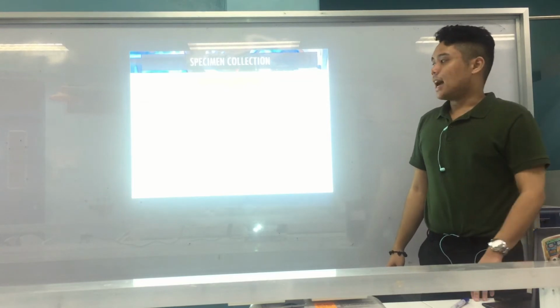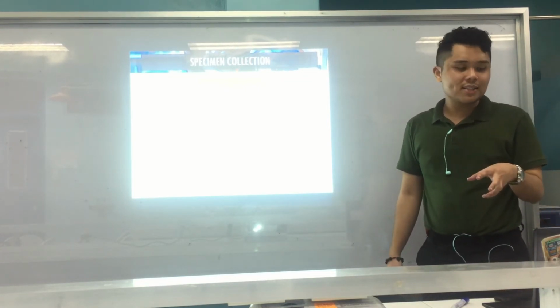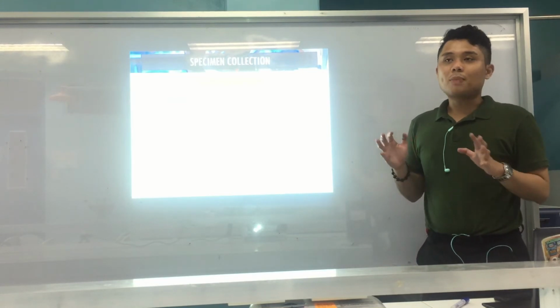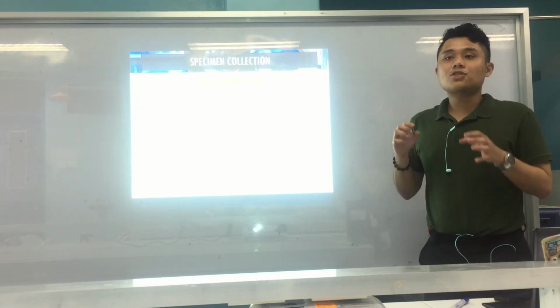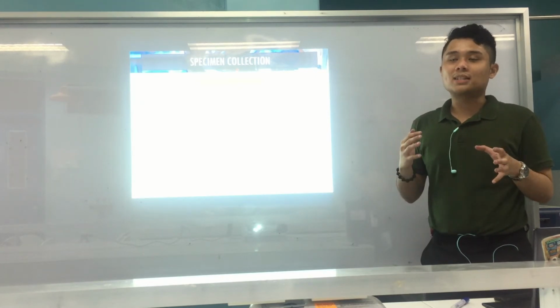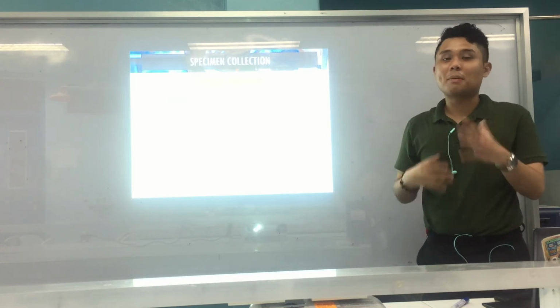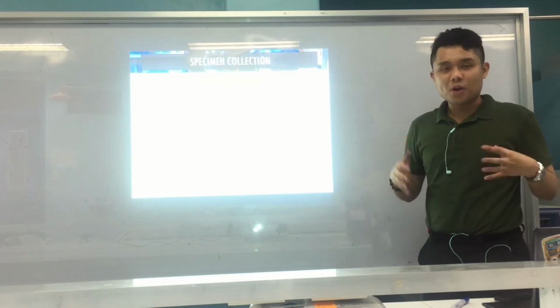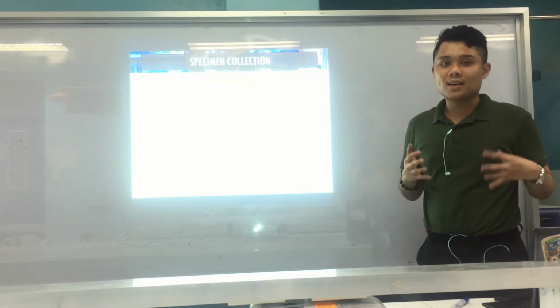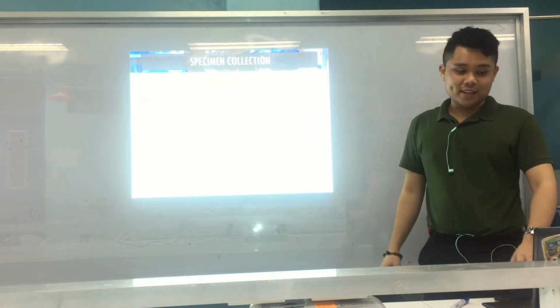Okay? Alright. Now, again, it's best to collect the fecal sample during the acute phase. When you say acute phase, it's the start of the infection. So if you collect during the acute phase, you will ensure that you get the pathogens at their peak, meaning there are still many of them because the infection has just started. Okay? So there is no treatment yet, and it hasn't been long. So it's fairly fresh and there are many pathogens present in your specimen. So, it's best to collect it at the acute phase of the infection.